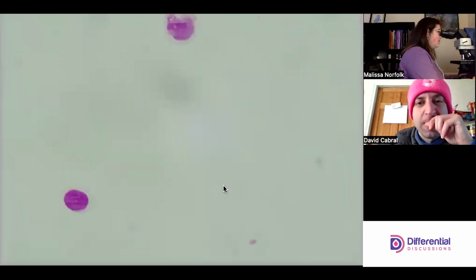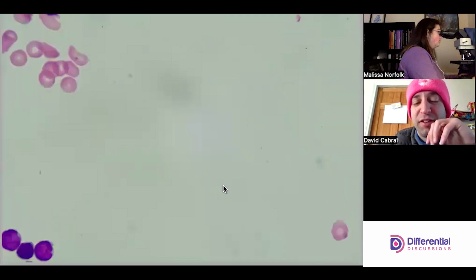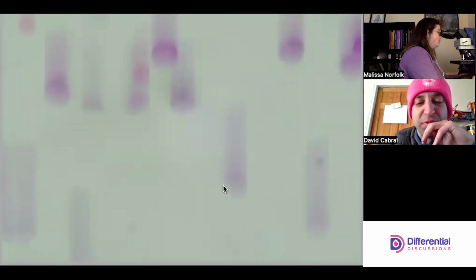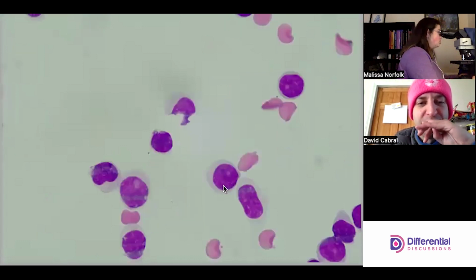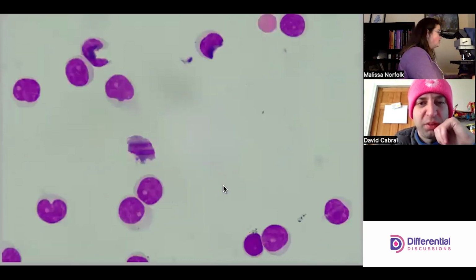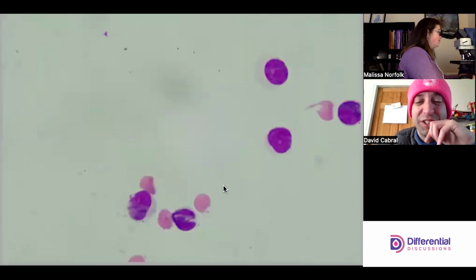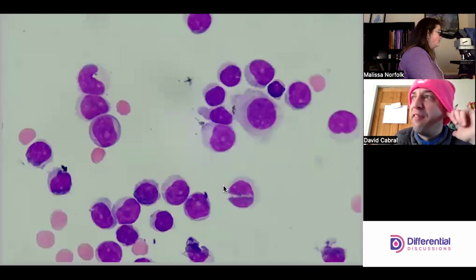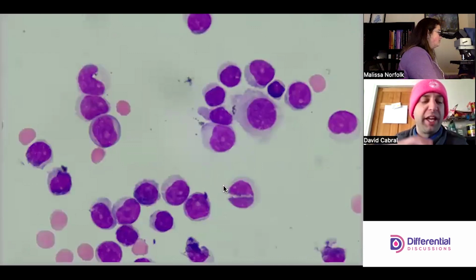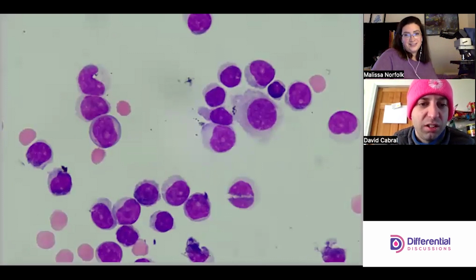And hey, path might come back and say, no, that's just a meso. Path comes back and says stuff we don't expect all the time. But who knows? It could be just strange looking mesos. It's possible. Not the balls of things though. I know that's not good. In truth, I don't know that I've ever seen a situation where they had clumps of cells like that and it was totally fine.